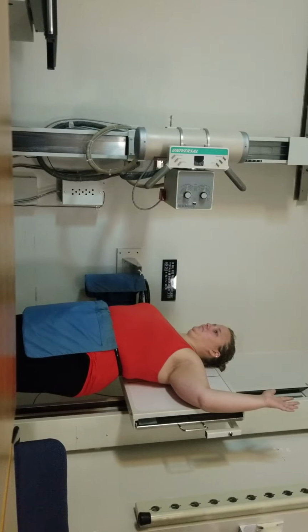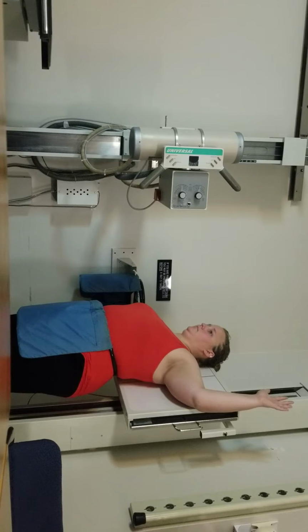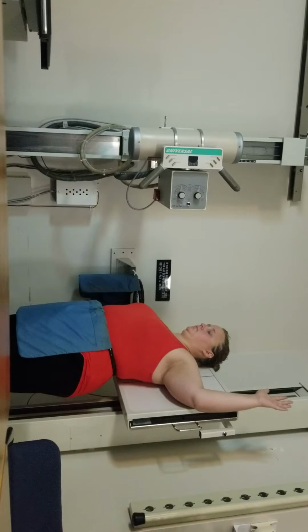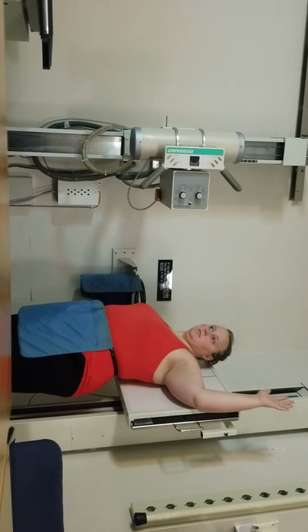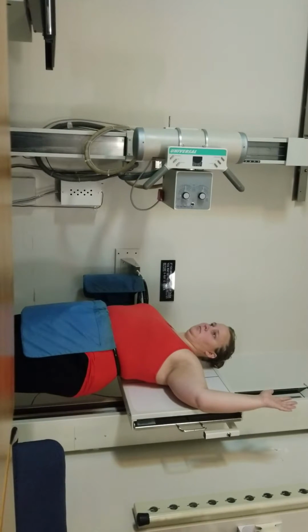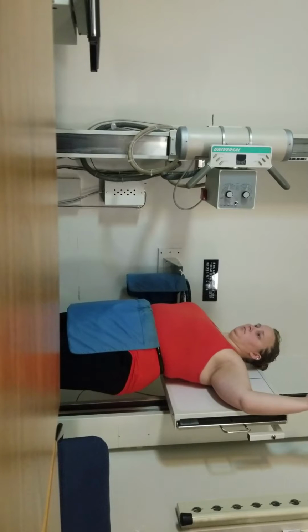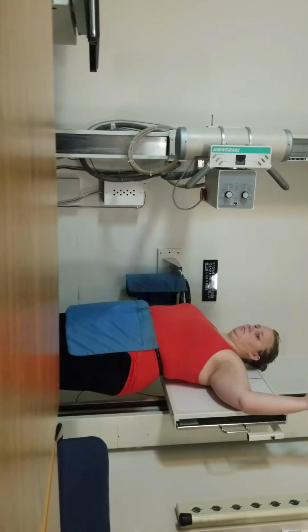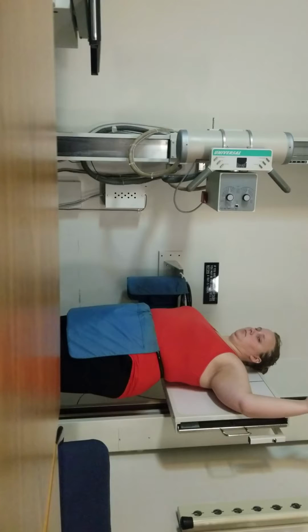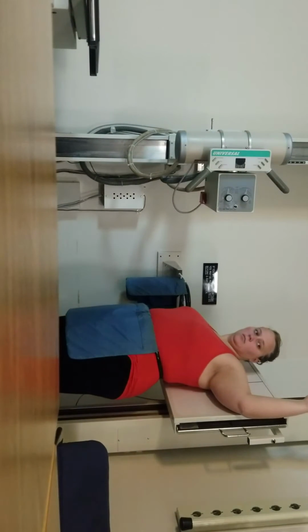So what do we usually use for an AP shoulder? What do you guys usually use for an AP shoulder? Just hold still. Okay. But for a technique, I'm going to use 80 kVp at 8 to 12 to 15 mAs. Everybody good with that? So I'm going to ask Ellen to take a deep breath in, blow it out, hold her breath, don't breathe. You can breathe. Now, if I could get a breathing technique, what would that breathing technique do for me? It'd blur out the ribs so I can see the scapula.